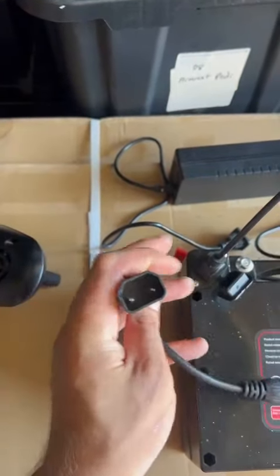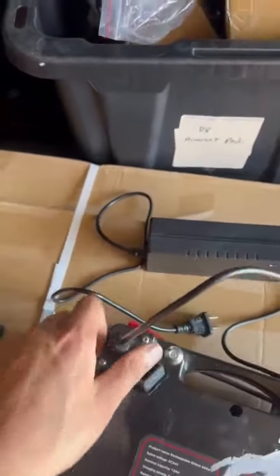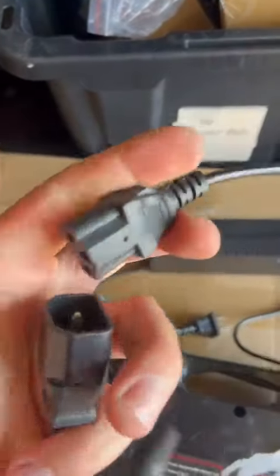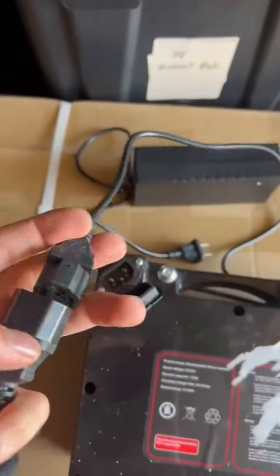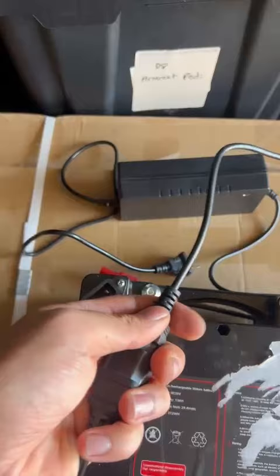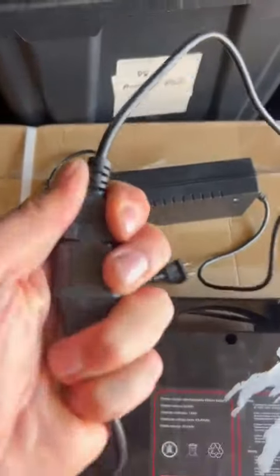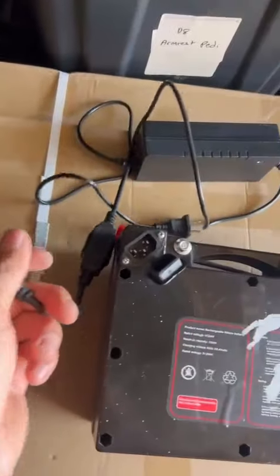But if you are trying to use this extension wire, this is not for connecting directly to the battery — this is for the connection to the charger. You can connect it here like this, and then charge it from the joystick.